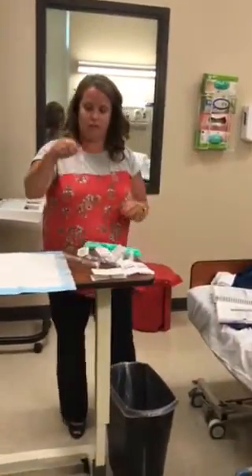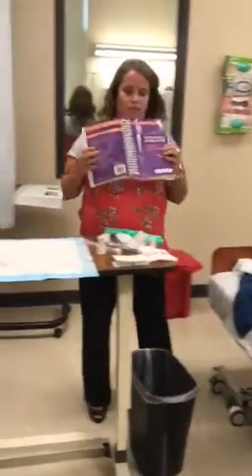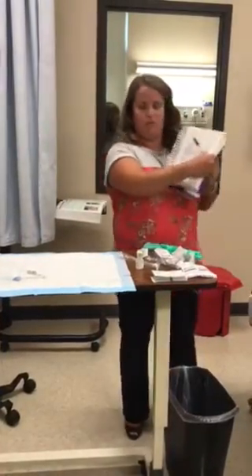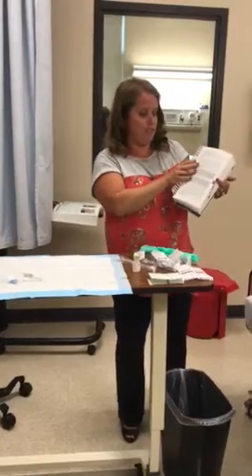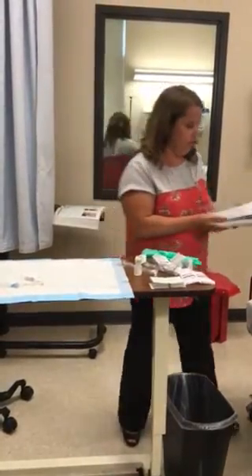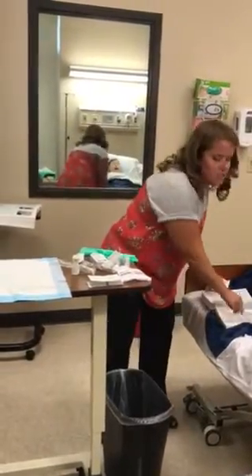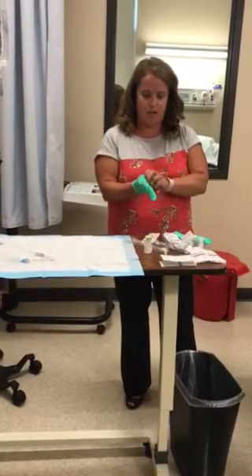We're going to have our drug called Toradol or Ketorolac, and we're going to grab this book and look up the rate of administration. It's under a little blue header and it says evenly distributed over one to two minutes is preferred. We have one mil of that and our equation is seconds per line. If you need help calculating this, stop by my office and I'll be glad to help.